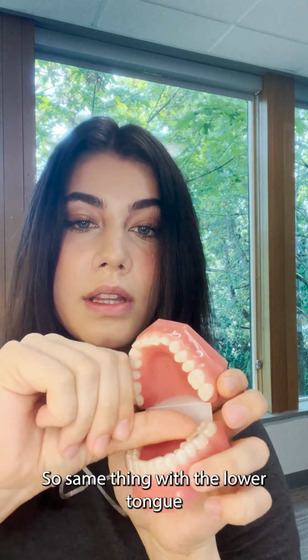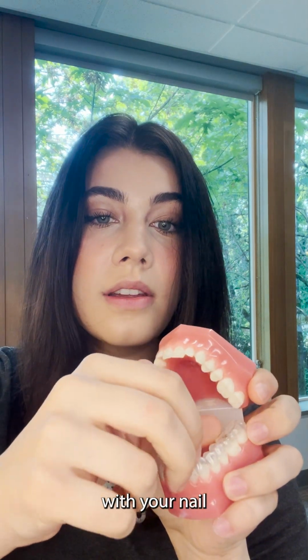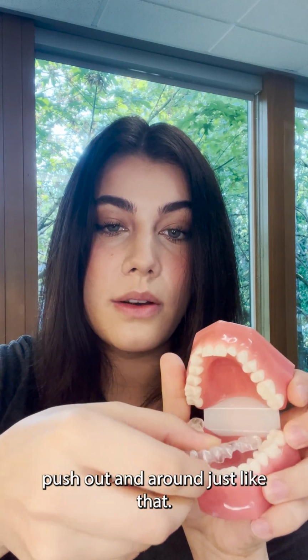So same thing with the lower tongue side of the tooth. On that very last one, you're gonna bring it up with your nail, and really just making sure you're pushing out instead of pulling up right up against those attachments. Push out and around, just like that.